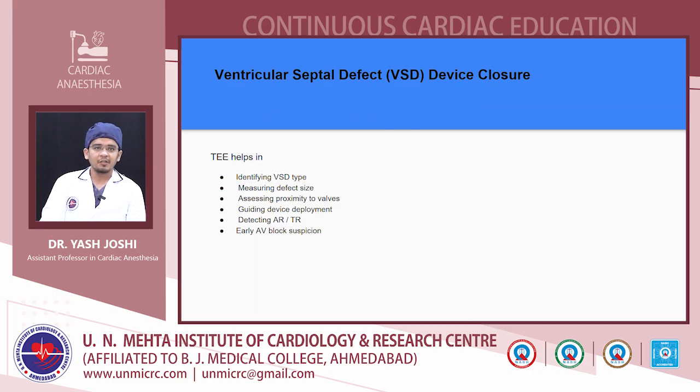Now, coming to the VSD device closure, transesophageal echocardiography helps in identifying the type of the VSD, the size of the defect, and assessing the proximity to the valves. It guides the device deployment as well as the detection of early complications like aortic regurgitation or tricuspid regurgitation.